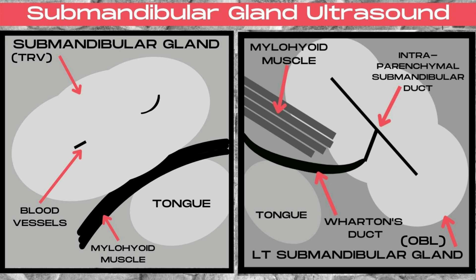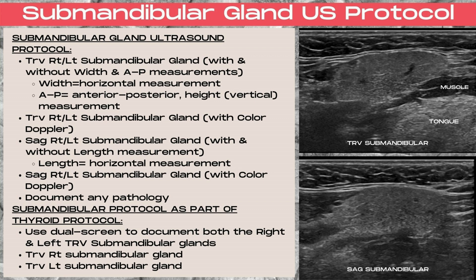It's exceedingly challenging to visualize Wharton's duct unless it is dilated and abnormal, so do not get discouraged if you cannot find this unless pathology is present within the duct. The intraparenchymal submandibular duct would run through the middle when it is visualized. The submandibular glands can also be imaged separately by themselves on an ultrasound or as part of a standard thyroid ultrasound protocol.